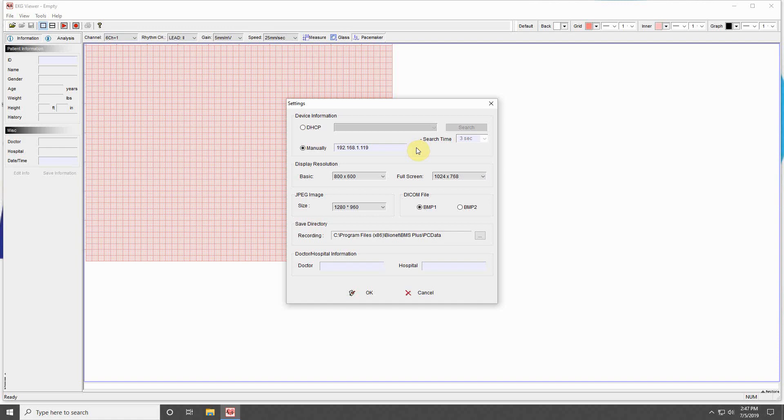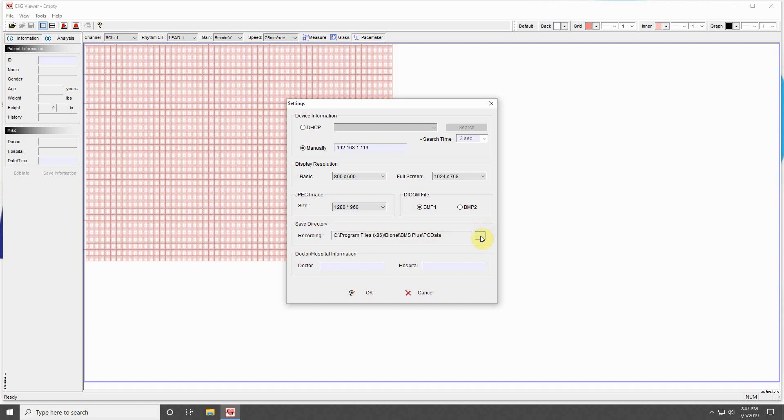Below this, you can control the size of the display image and full-screen image. Next, you can select how big the saved JPEG file should be and what setting is best for your DICOM connection. The last two settings allow you to set the folder location of saved files and a specified doctor and hospital for your practice.